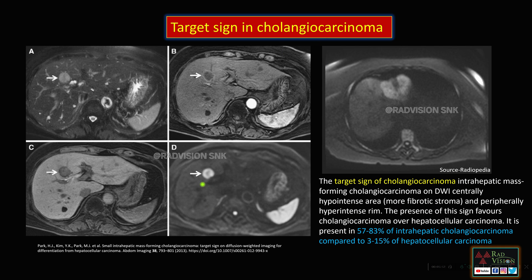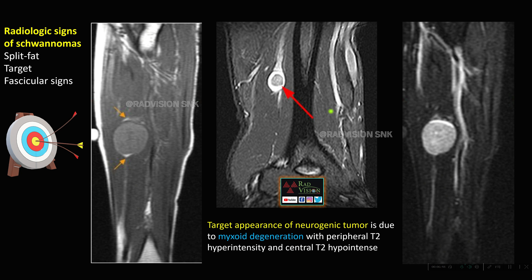Target sign can also be seen in cholangiocarcinoma. On diffusion weighted imaging, you can see diffusion restriction with a central hypointense area, seen in intrahepatic mass-forming cholangiocarcinomas. Whenever you are in doubt whether this is cholangiocarcinoma or HCC, look for this target sign on DWI: peripheral hyperintense restricted diffusion with a central hypointense area due to fibrotic stroma. This is seen in 57 to 83 percent of cholangiocarcinomas compared to only 3 to 15 percent of hepatocellular carcinomas.